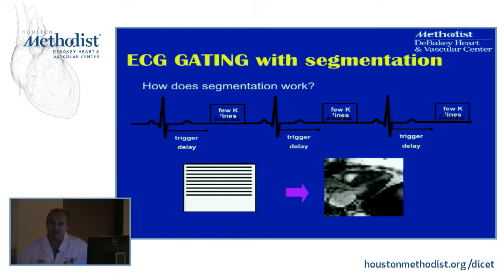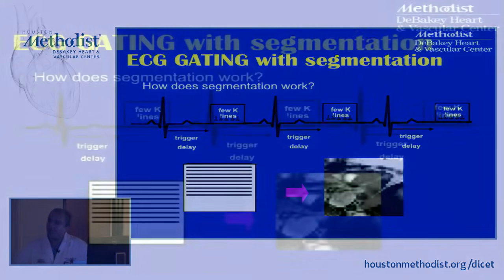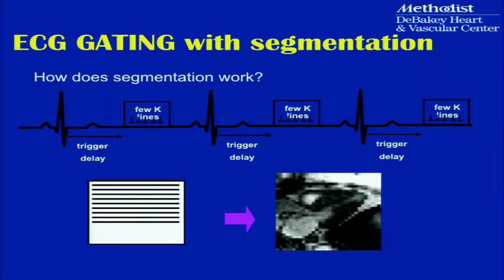Now the one difference is, for example, for those of you in the echo lab with some 3D echo techniques, or those of you in the CT lab with CT techniques where you're actually acquiring different data and then stitching it together to generate a full volume, the difference with CMR fundamentally is that each line of data that you acquire somehow contributes to the formation of the image.